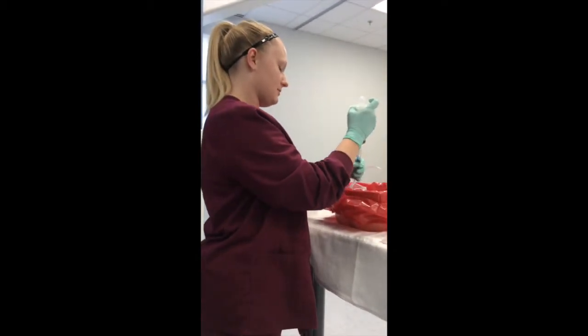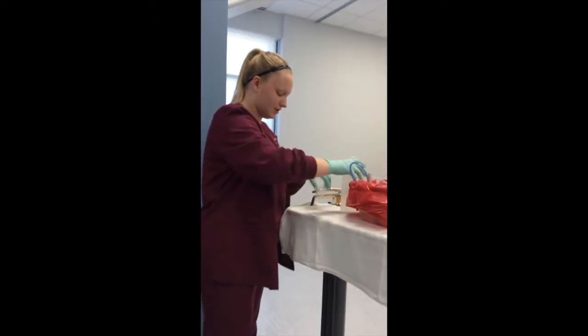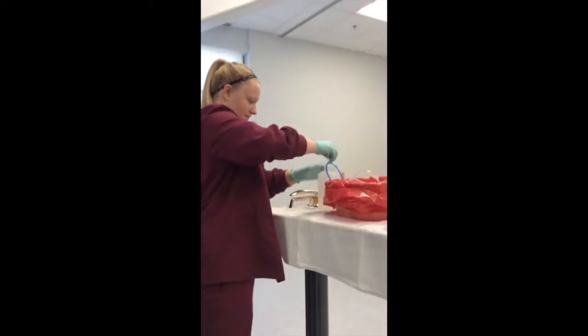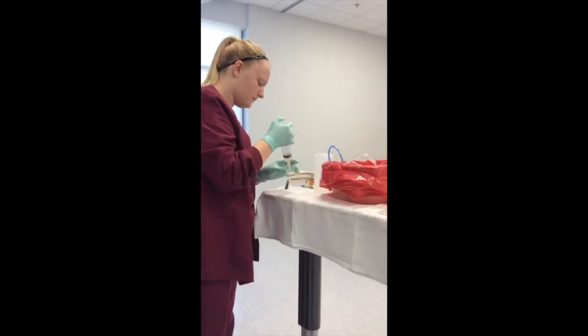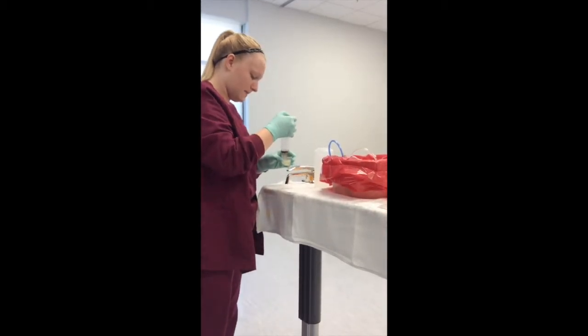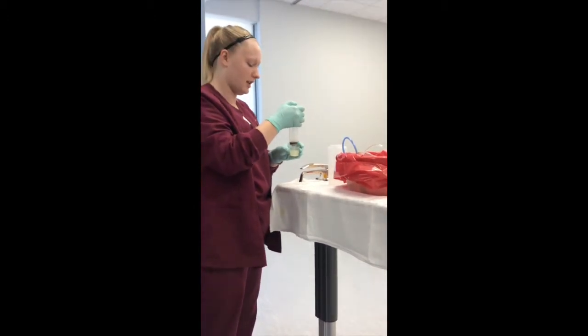Okay, I'm going to clamp and mix my medication with about 10 milliliters. Should be enough. Make sure it's mixed up really well. Sometimes you need slightly warm water to get some medications mixed up.